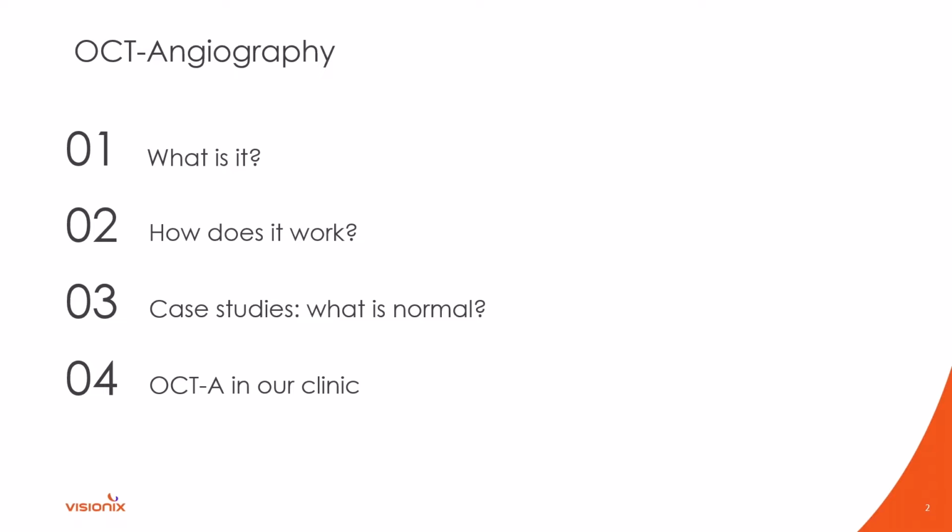So again, we're going to talk on that, and then we'll end with some case studies this evening over about 4 different cases, and we'll continue that 4 weeks from now on November 9th with part 2.